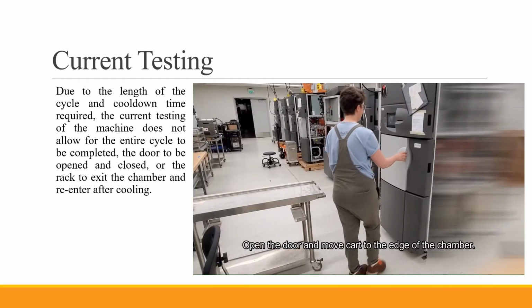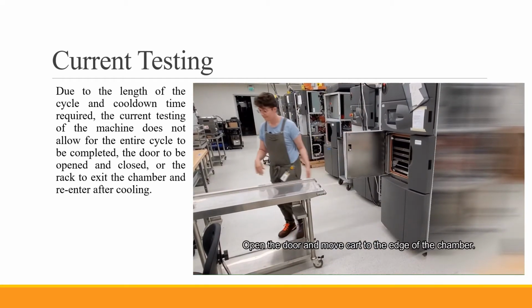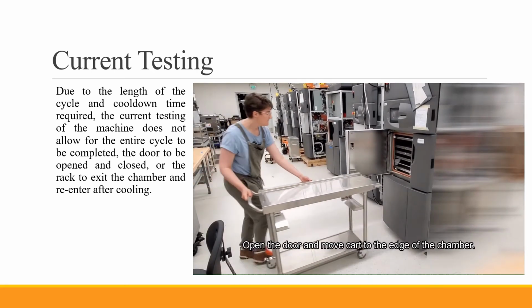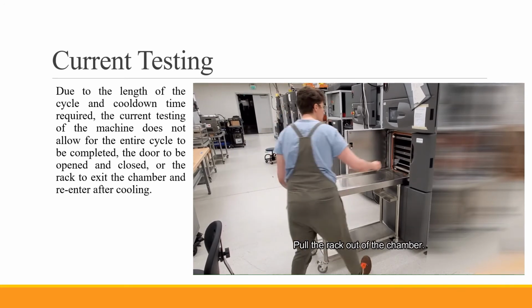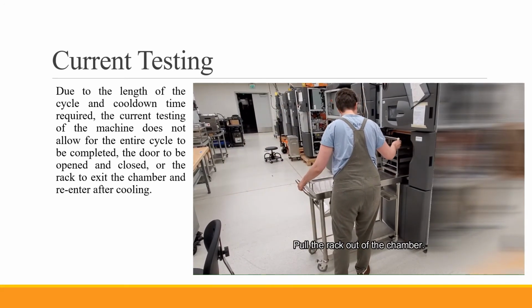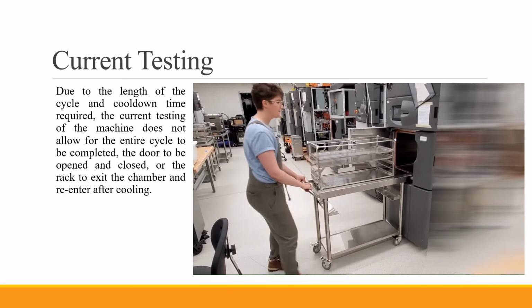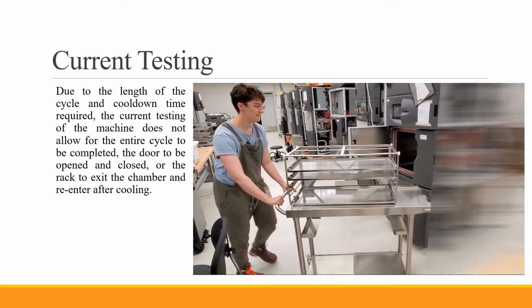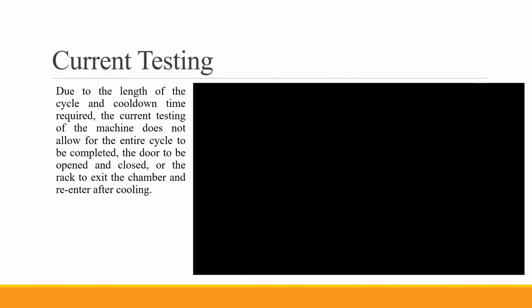When completed, the operator opens the door and moves the cart to the edge of the chamber. The operator then pulls the rack out of the chamber onto the cart. The cart can then be wheeled away for the rack to cool down to between 23 and 25 degrees Celsius to then repeat the loading process. The cooling down time takes anywhere between 20 to 30 minutes.